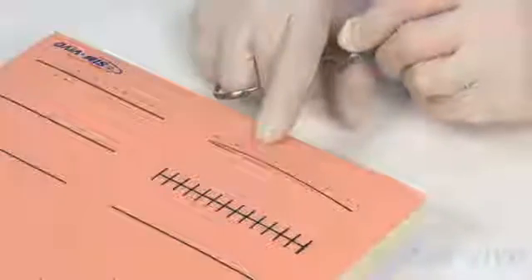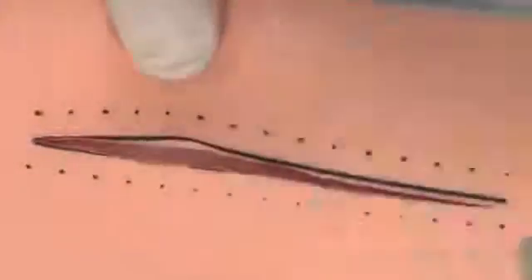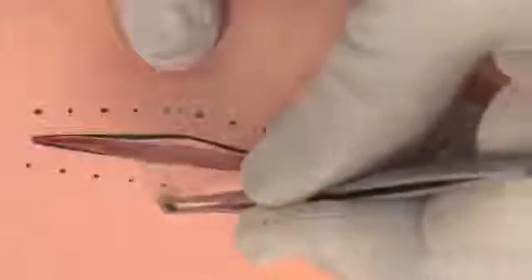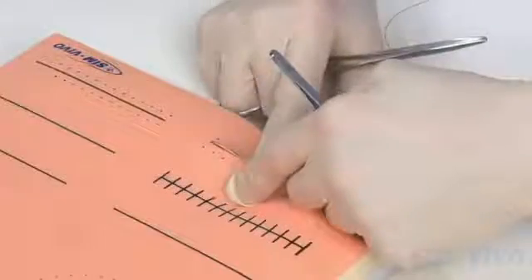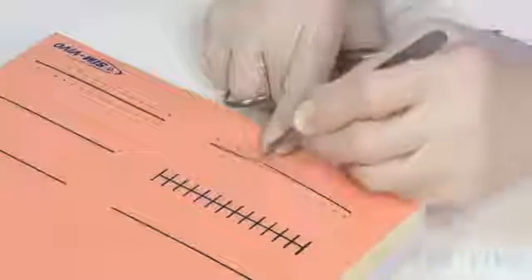In order to treat this, surgeons developed the vertical mattress suture, which we're going to demonstrate. The purpose of a vertical mattress suture is to use a large bite, far away from the wound, to bring the wound together, then a small bite to approximate the edges of the skin.